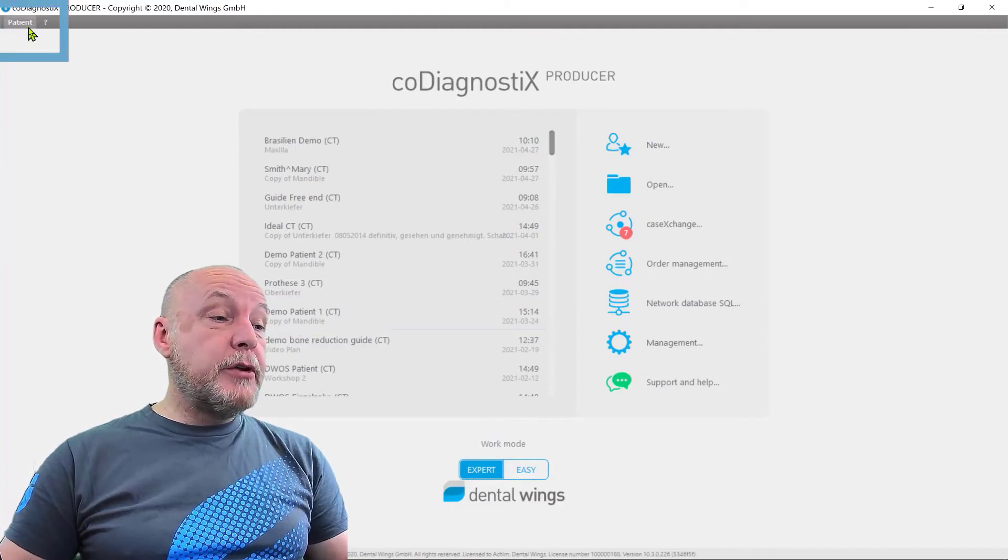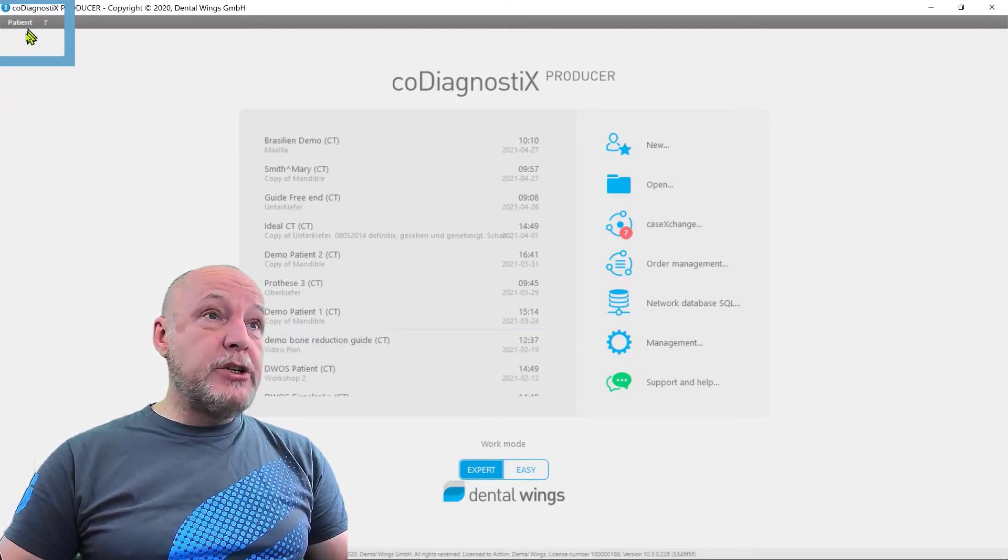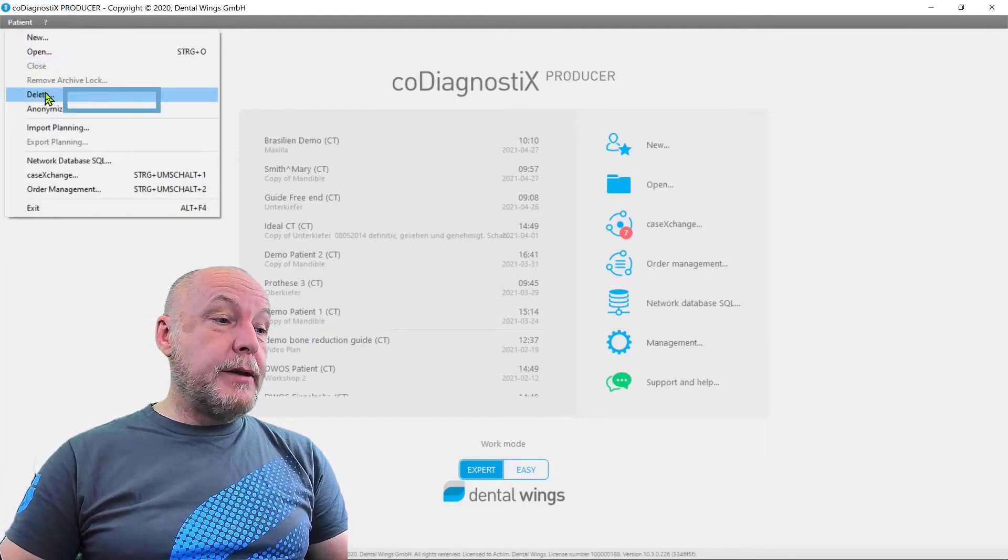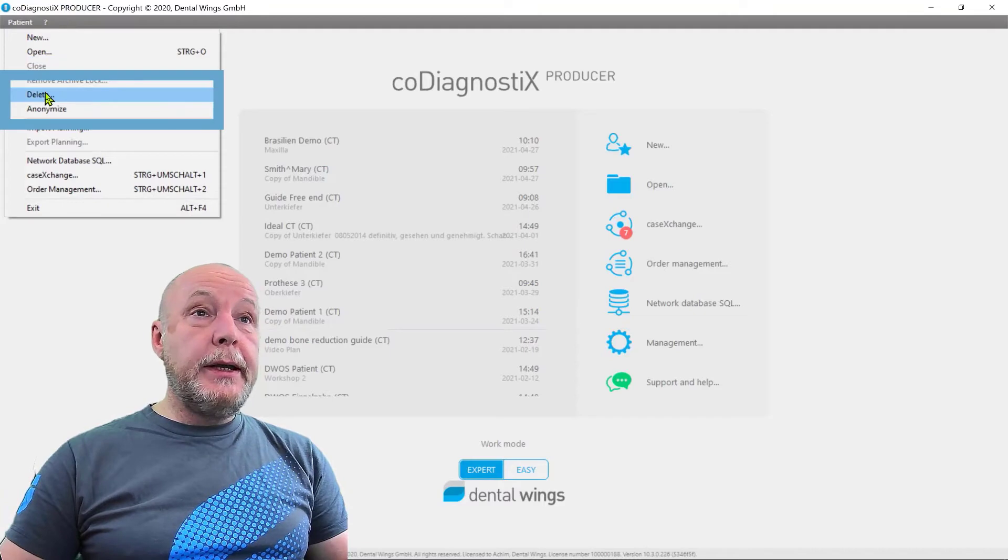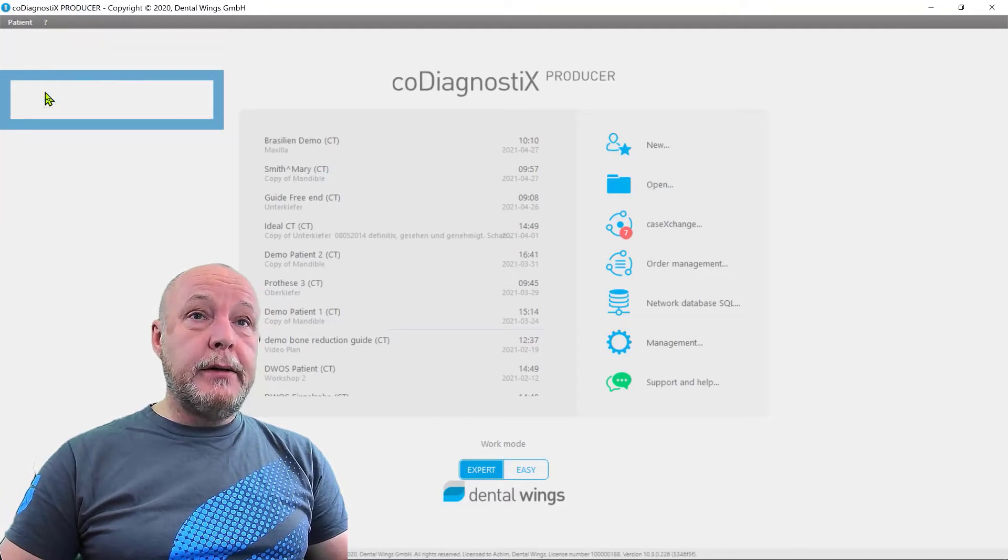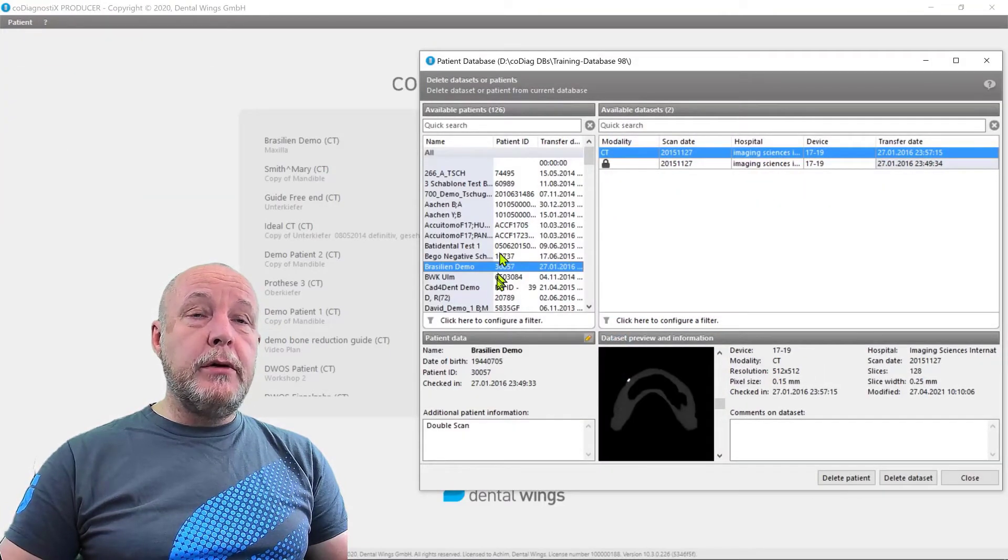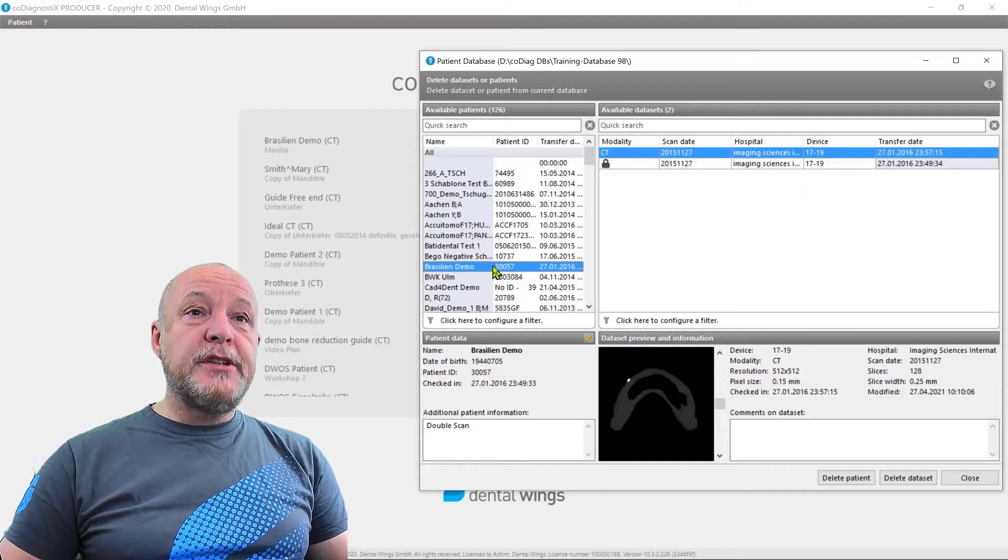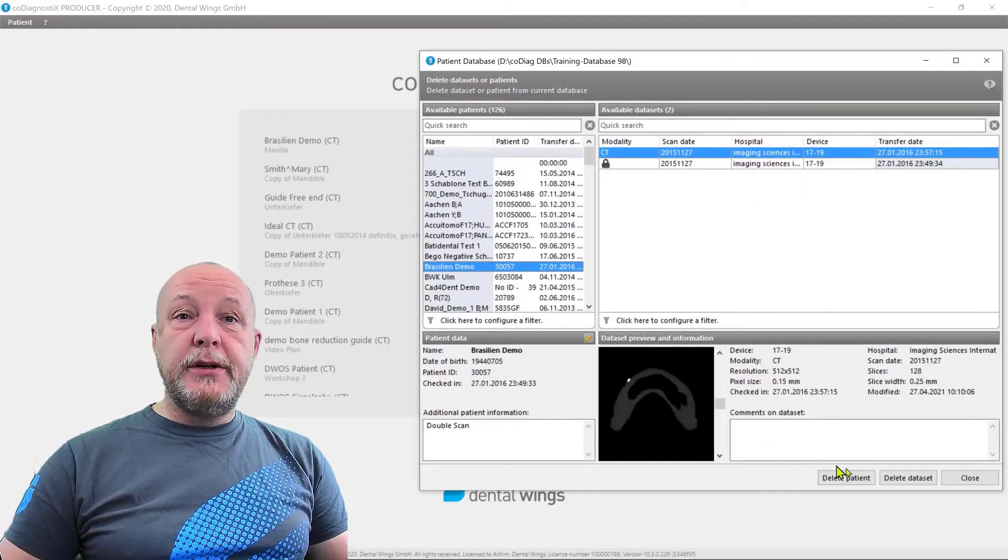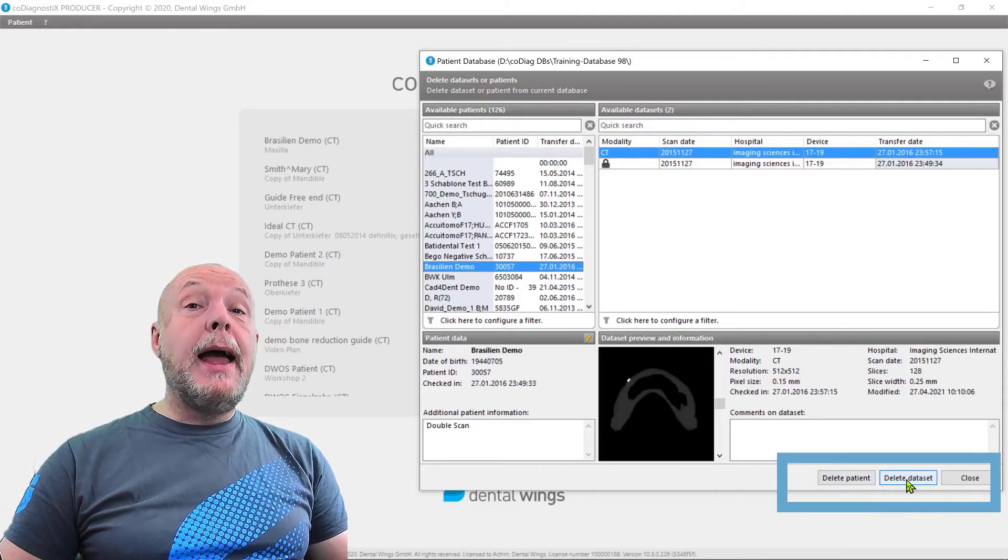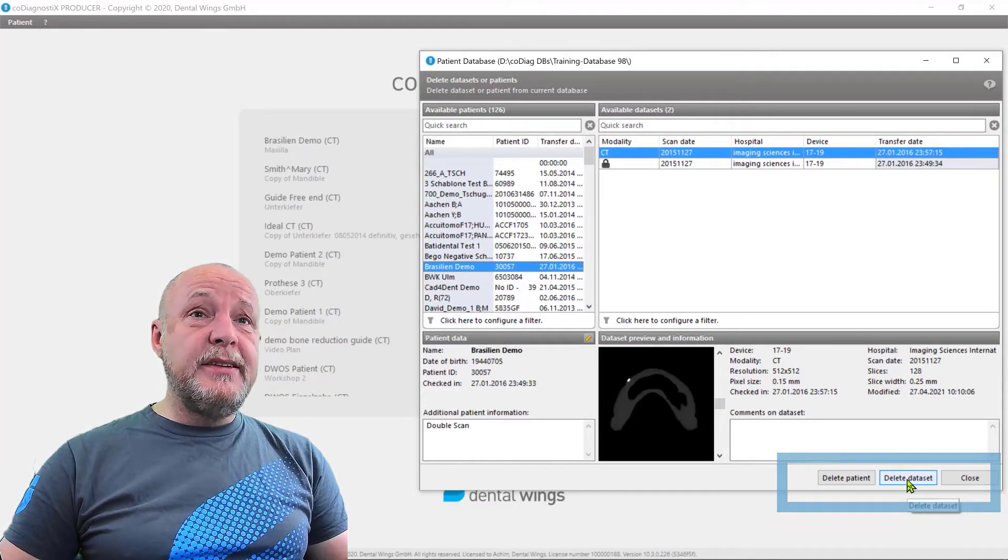So you have to go on patient, you find the delete button here. We have an additional window where you see your patient. You can delete a patient and you can delete data sets.